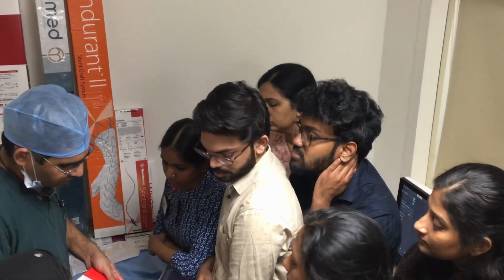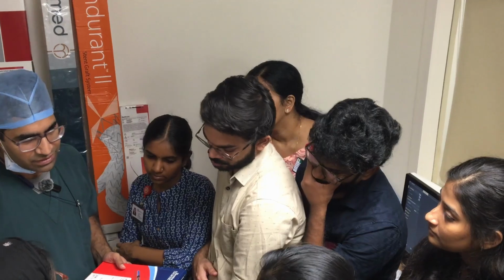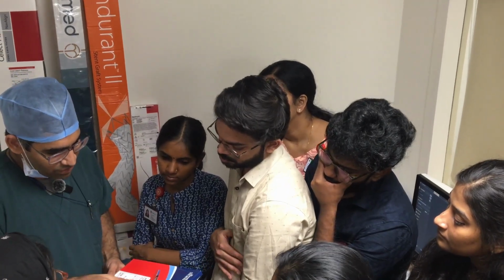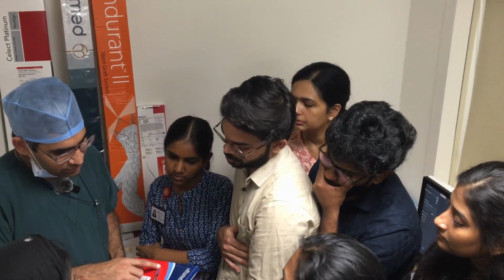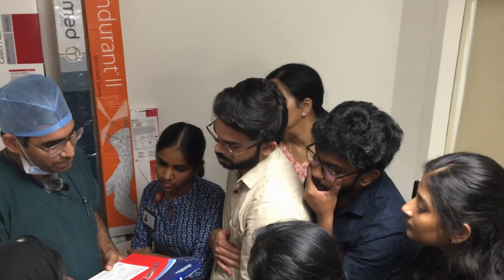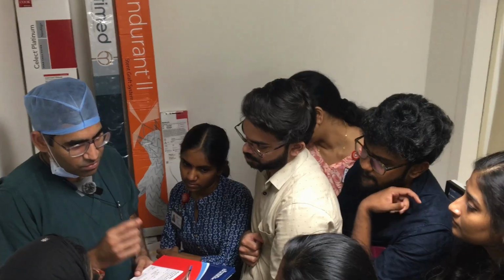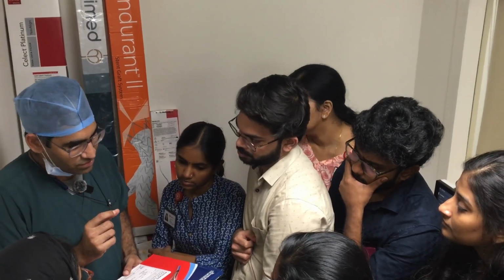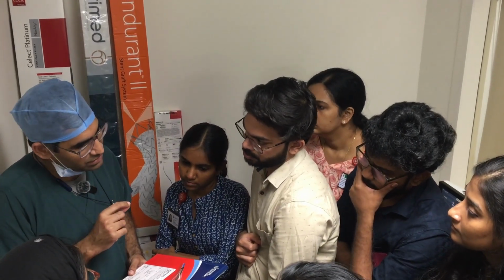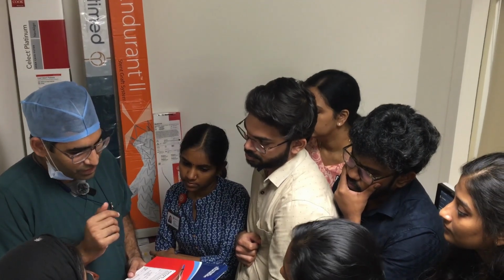So there is one which is compliance based, and the other is the over the wire and rapid exchange system. What we use, most of the balloons, the wire comes from one end and comes out through the other end. Okay. The advantage of that is it has more pushability. So if you fix the wire, fix the lesion, and push it, it will go, it will track better.